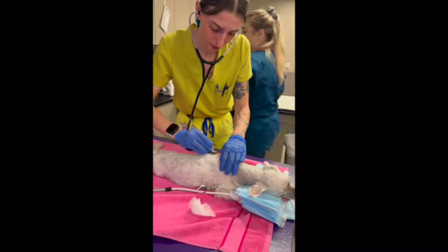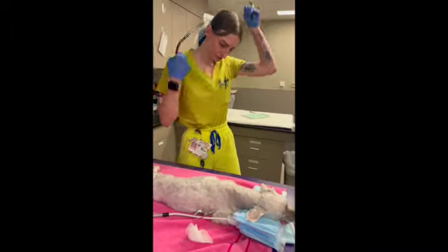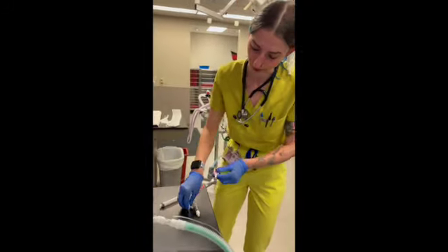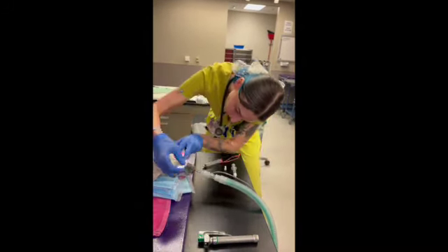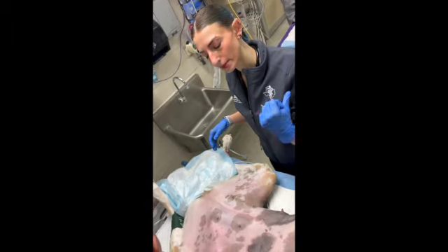Sounds good on this side. All right, it sounds great on both sides. I hear lung sounds. And then we will just take our eye lubrication and lubricate the patient's eyes. Good job, friend. We're just going to express the bladder before we take the patient back to the OR.